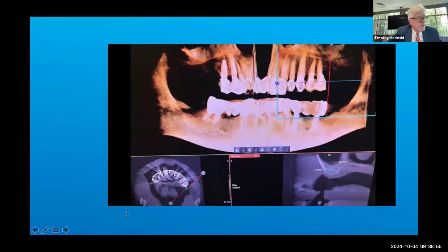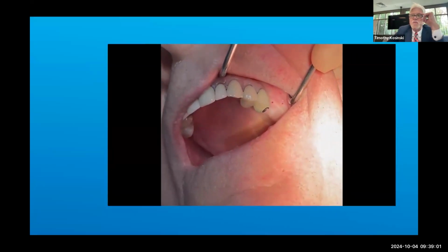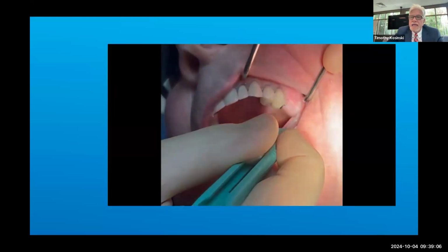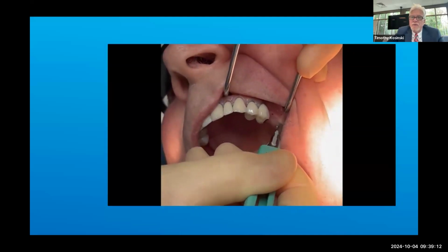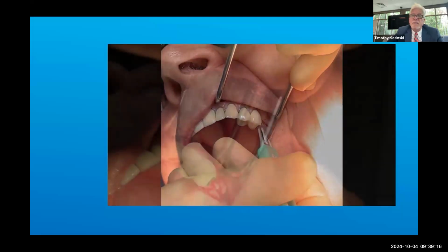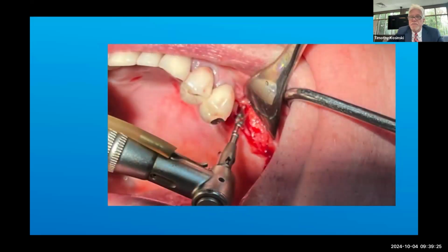And again, we have some videos, and I want to go through this information. We're afraid of the sinus, and we can predictably lift the sinus floor 3 millimeters and immediately place an implant. But I want my implants to be 70% in viable natural bone. We can lift the sinus floor by tenting up to 6 millimeters. This is not something that you need to be afraid of. You need to respect it. So here I reflected my site with my envelope reflection.